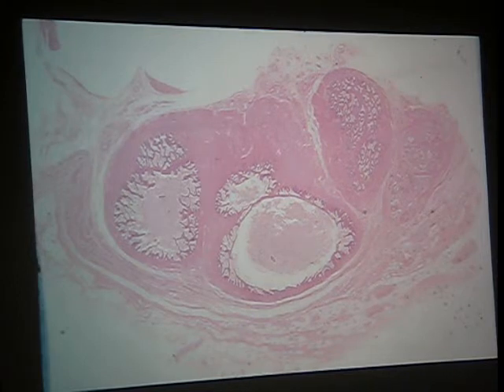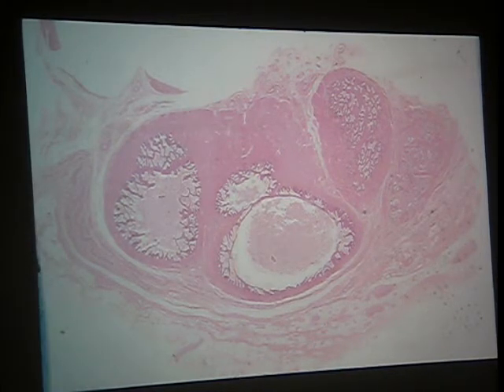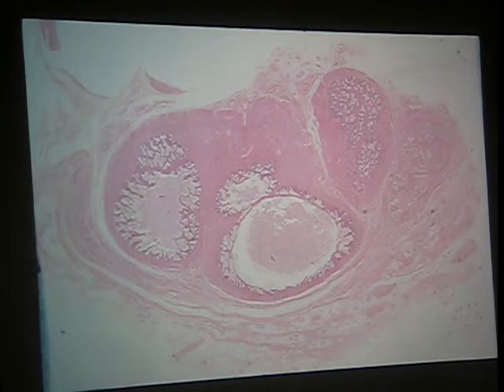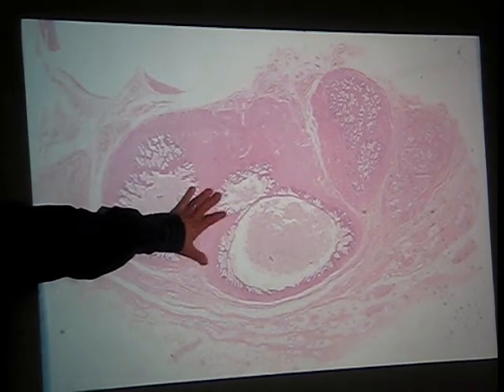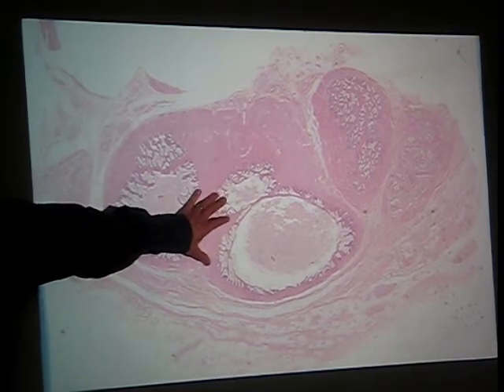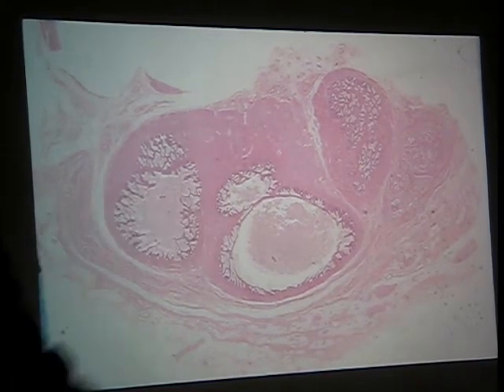And if you were worried about it, you would go to high power on the oviduct, and what type of cells would you expect to see? Ciliated columnar, simple, with peg cells. And that's going to make you feel real comfortable about oviduct and not get confused here. All right? So, plicated mucosa, big lumen. Did I say something that was unclear? No.